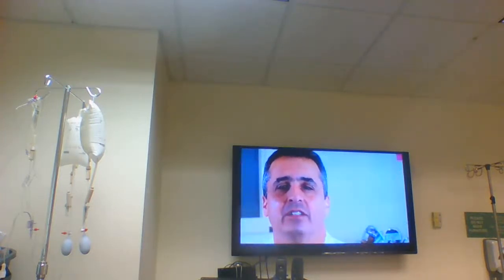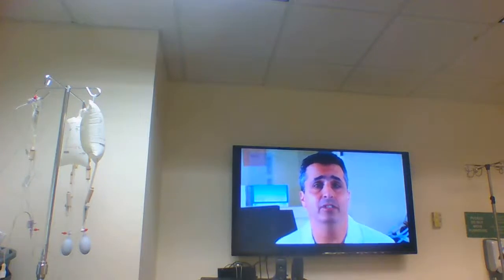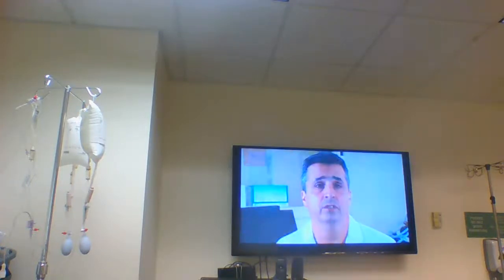Although radial artery occlusion is thought to be rare and mostly asymptomatic, it is important when we are dealing with re-access of the radial artery. Low pressure hemostasis enables blood to flow through the radial artery while pressure is applied in order to reduce the likelihood of radial artery occlusion.